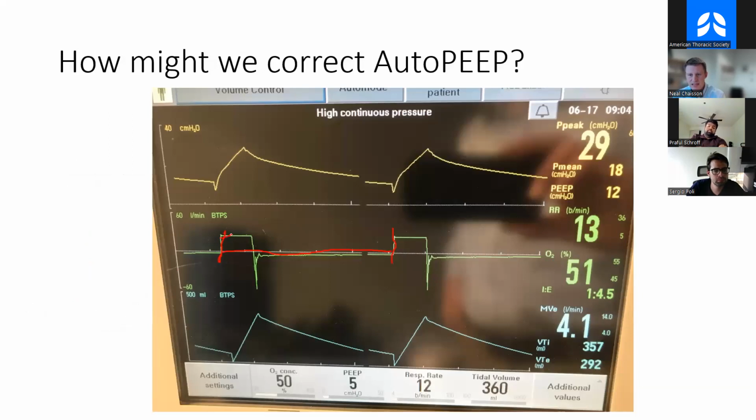How much different is the inspiratory time here? Did we change the inspiratory time at all? We did not, okay? The only way to change the inspiratory time is to change the I to E ratio or the flow rate, and I'm not going to go into that, but that's another way. So we could, I heard someone say, shorten the inspiratory time, shorten the amount of time that it takes to get this full breath in. But which one do you think is going to be more effective? Shortening the breath in or lengthening the entire duration of the breath?